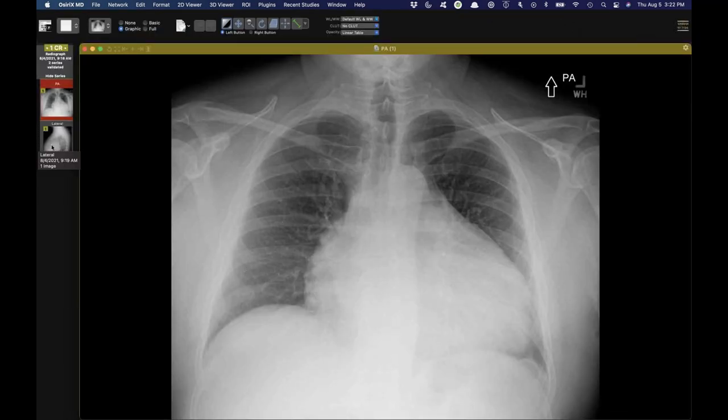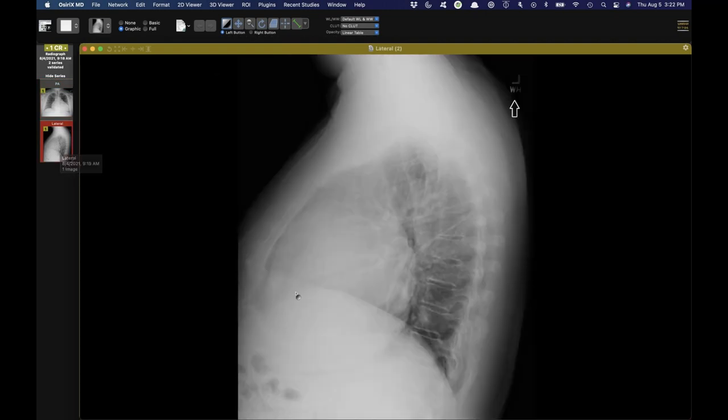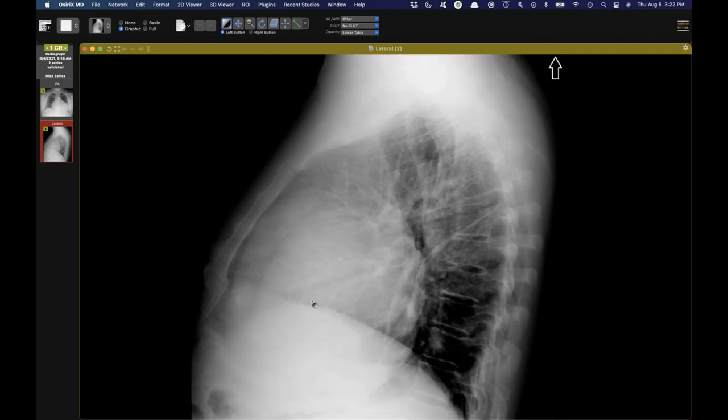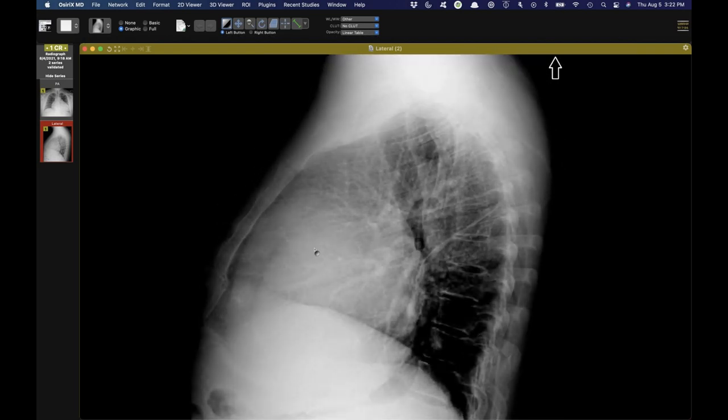because this is a finding that you taught me about. Not the one on the lateral view, but clearly we can see this patient has an enlarged cardiac silhouette, and on the lateral view, this is one of the best examples of a fat pad or a so-called Oreo cookie sign that I've seen, where of course the fluid here is the stuffing, and the mediastinal fat and then the epicardial fat form the darker layers.